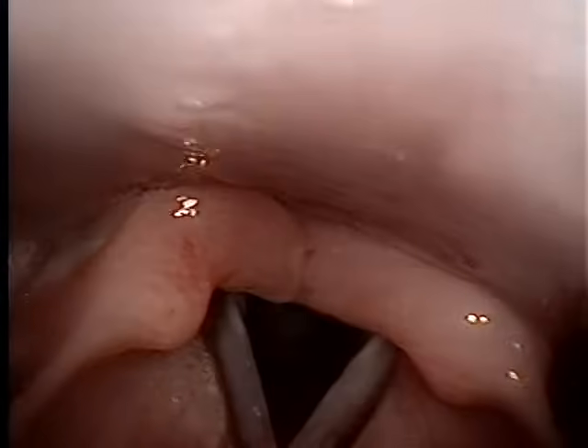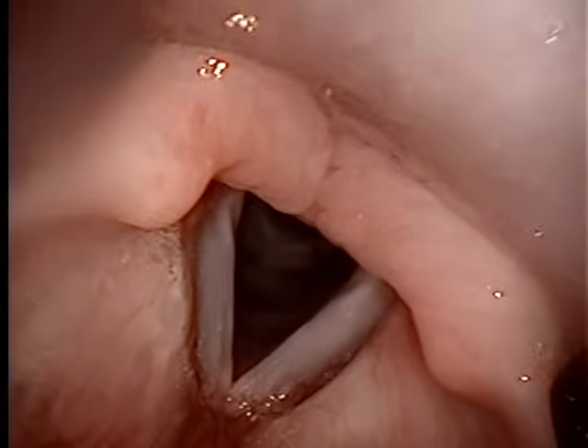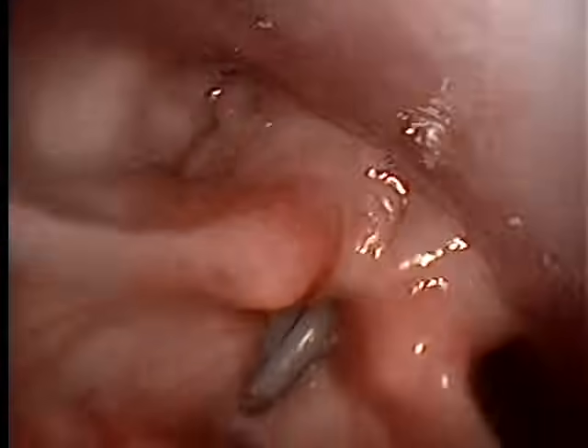Turn your hand just a little bit to the right. There you go, just kind of look to your right. And just gentle, quiet. There you go.